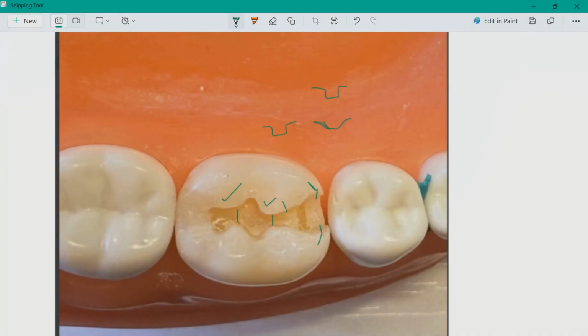Sound tooth structure. Okay, the axial wall depth. Molars. The depth of the axial wall extends beyond the DEJ 1.5. Now, is this the DEJ? If this is the DEJ, you're underextended. You still need to go another 0.5 or so. So 1.5. It feels like a lot, and it is. In normal dentistry, this would be a pulp exposure, but that's what they want.